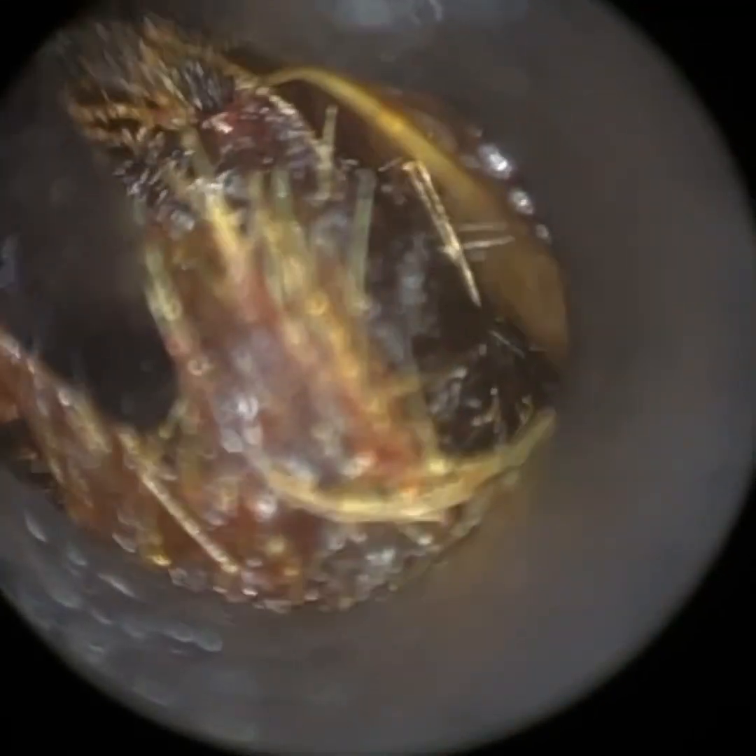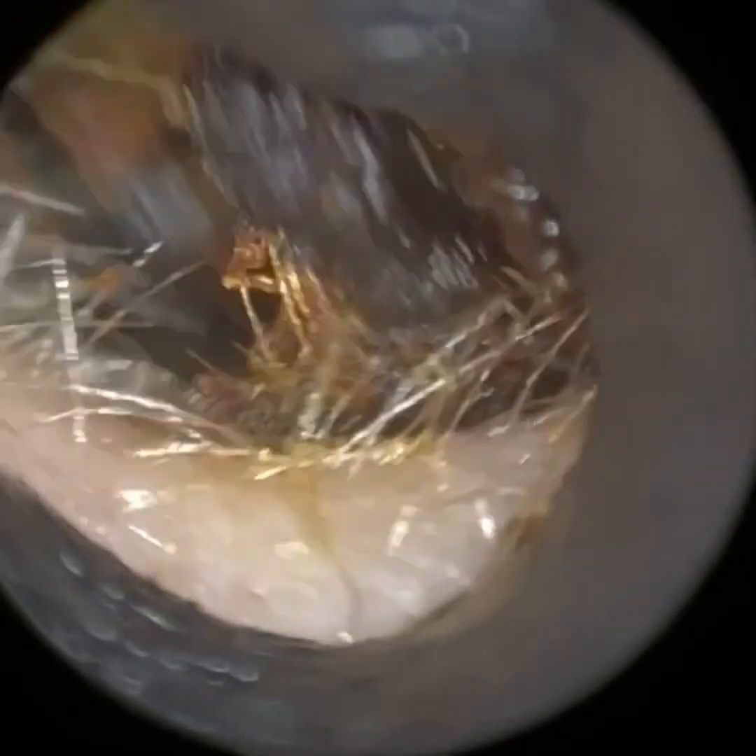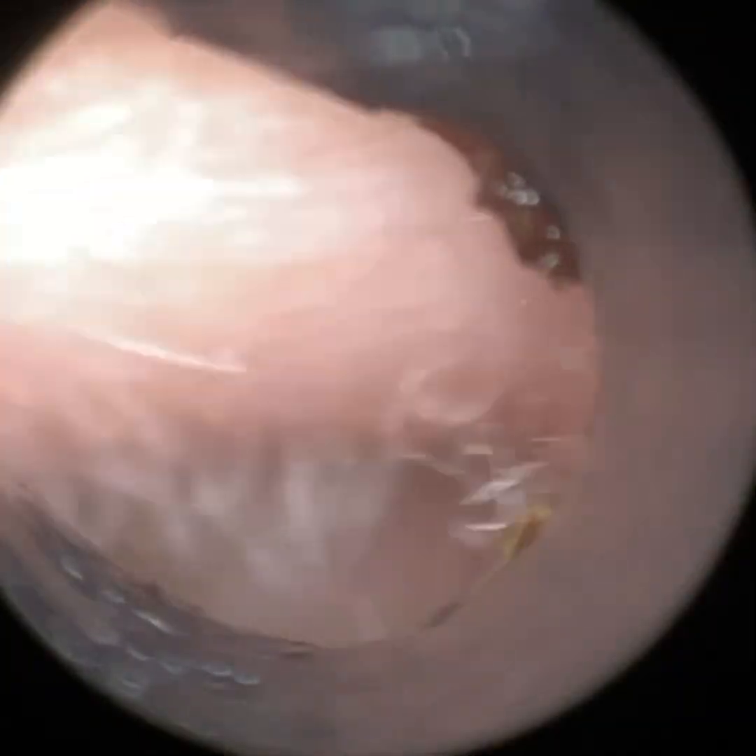This is one of the premises of developing the WaxScape — you can use the speculum just as you would when performing microsuction or earwax removal using head loops or a microscope. And you can see there we've just introduced an earhook. We've got a little working channel at the top where you can insert micro instruments without it affecting the view.